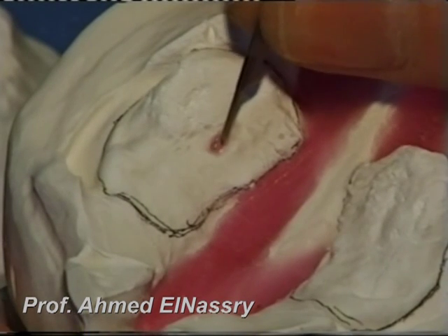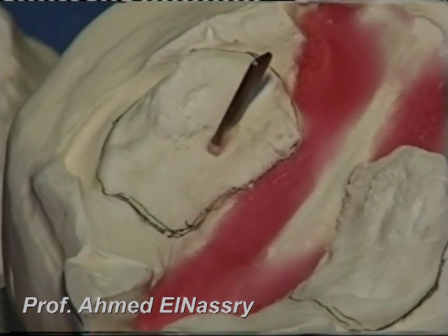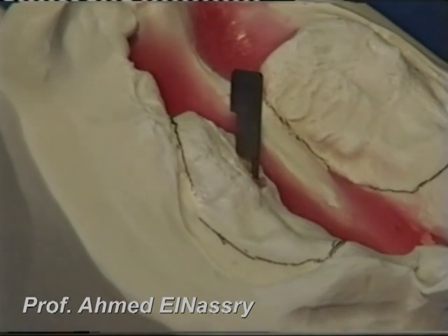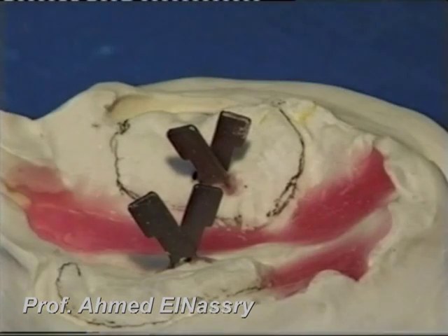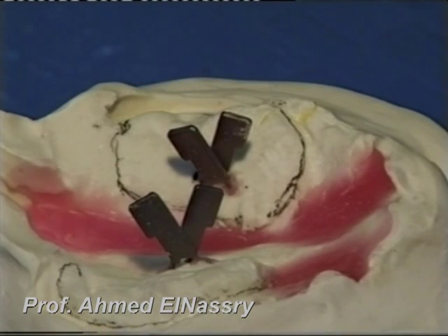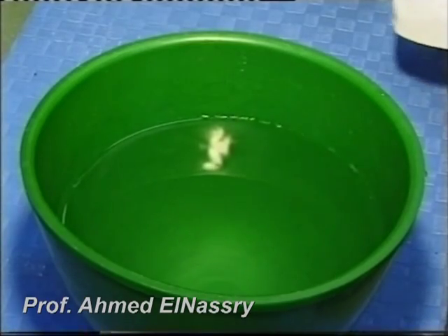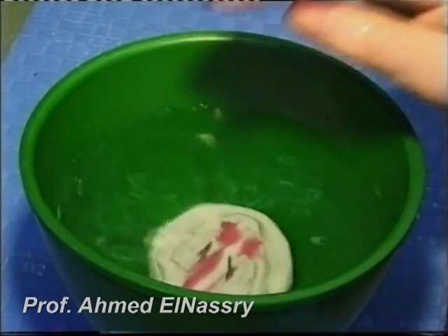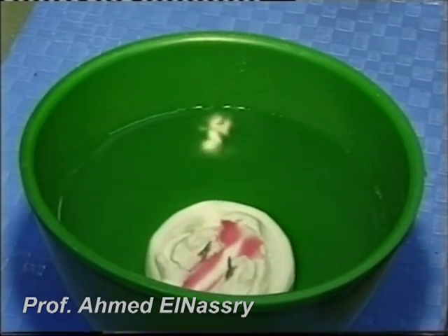Then you insert the pin director inside the hole, and repeat the same procedure for the other three pin directors in a criss-cross arrangement. The pins are used to retain the appliance inside the mouth. After that, you put the model in cold water in order to set the wax.